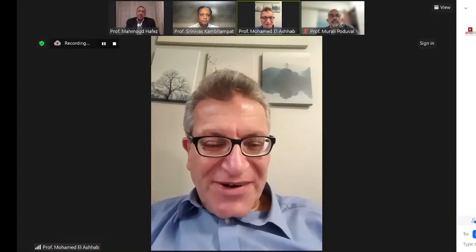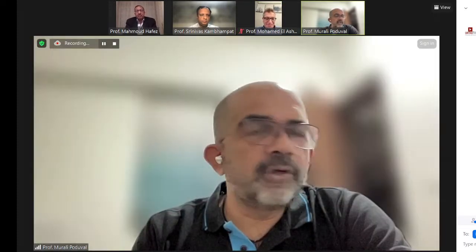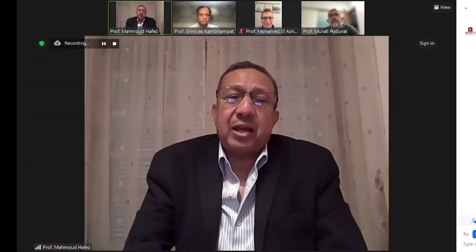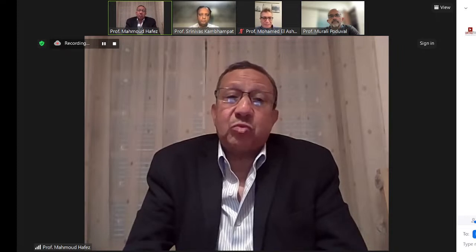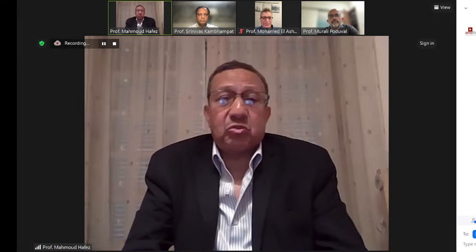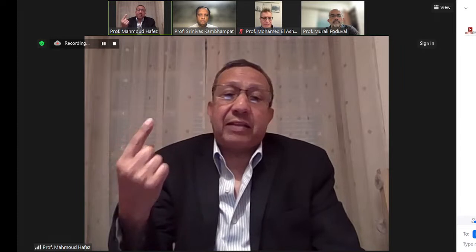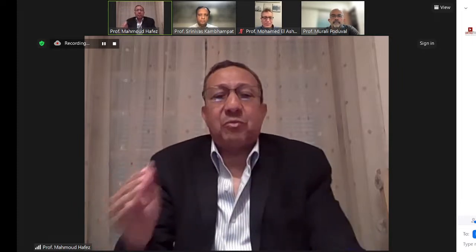Professor Murali, you have any questions, sir, or any comments? I have a few questions. Sir, do you use a tourniquet for your surgeries? I normally use a tourniquet, but I know many of my colleagues don't. When I use it here, my team is well trained on the draping of this bilateral with a tourniquet, because we have the tourniquet with two arms, right and left. So we put the cuff on, but I normally don't inflate unless I'm ready. I have this rule inside the operating room. I say, don't inflate unless I'm ready. I don't have to hold the knife in my hand, but I tell them when I'm really ready.